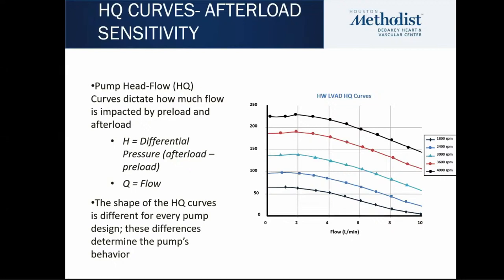Therefore, patients on LVAD support are sensitive to changes in blood pressure, to changes in preload, meaning volume, and to changes in LV contractility. Some pumps are more sensitive. We think that the HVAD is more sensitive to afterload than HeartMate 3. In the big picture, these changes are important, because patients on LVAD support are doing different activities during the day, moving around and exercising. This pressure sensitivity helps regulate flow in these patients with changes in blood pressure.